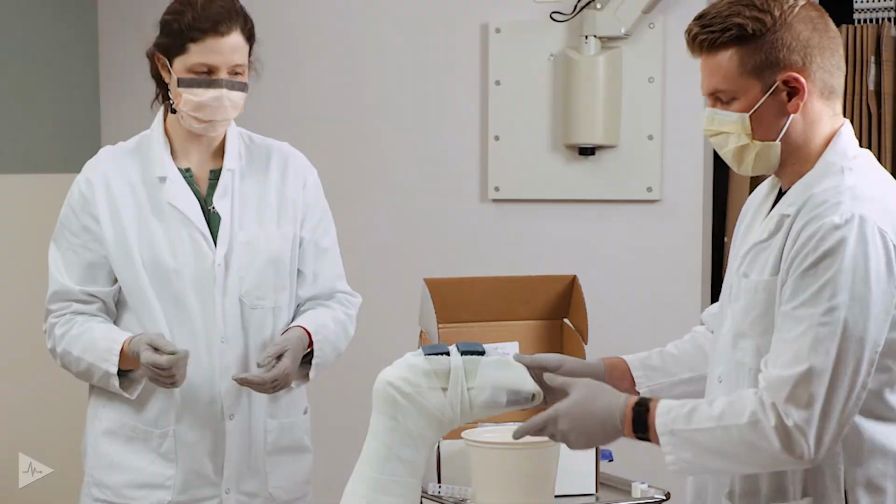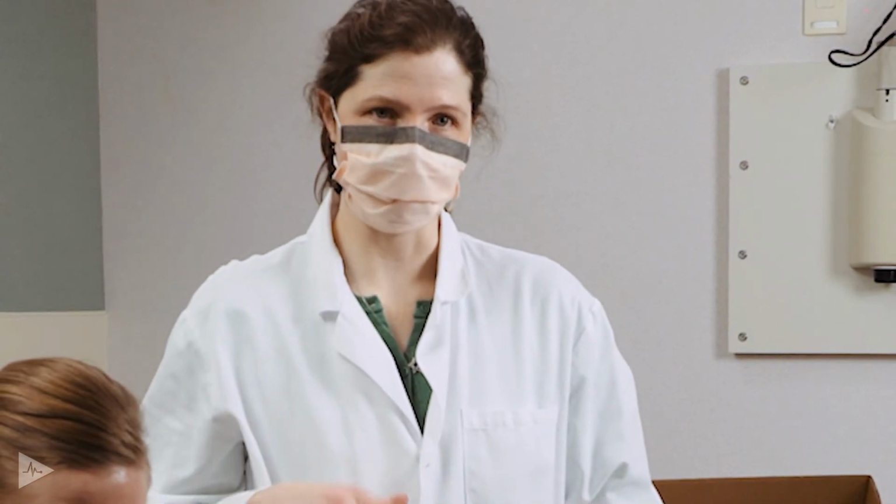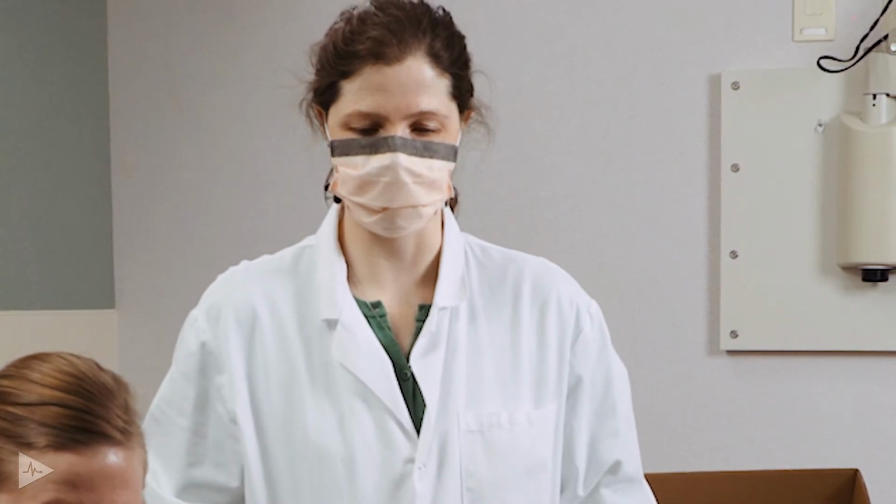As the cast is drying, then we will just want to assure the patient is not noting any areas of discomfort, pinching. She's not noting any loosening or shifting of the cast while it is drying. As long as there are no issues, once the cast is dry, then the patient can be dismissed with their offloading device.